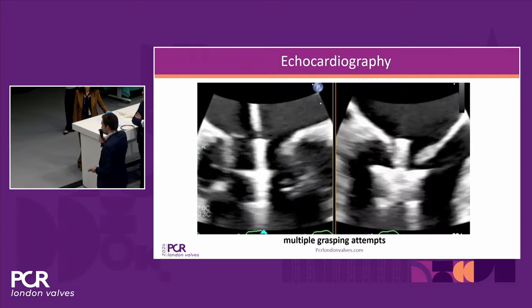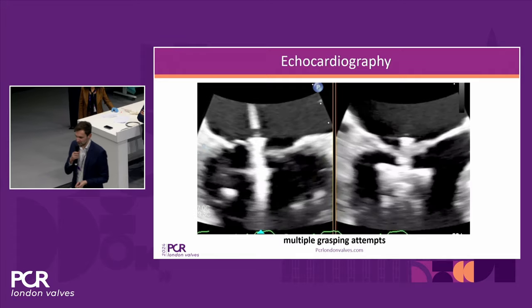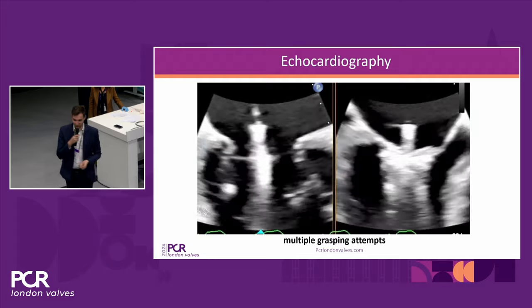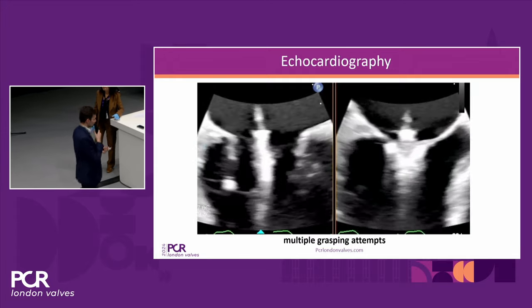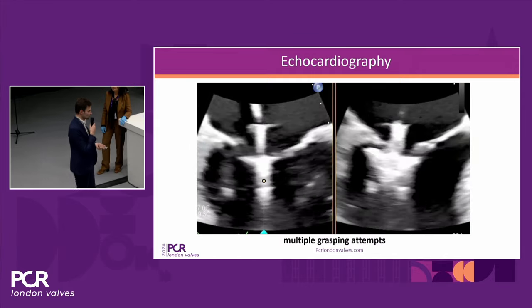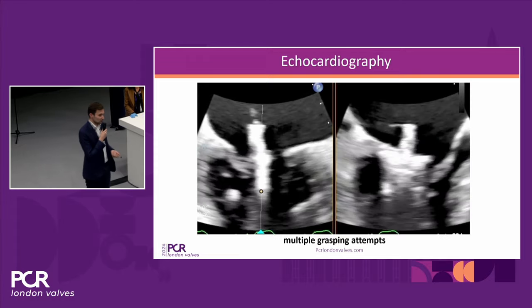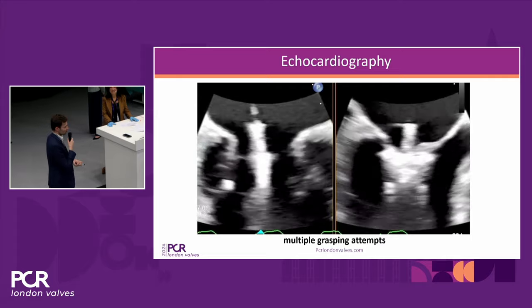And as you predicted, Francesco, we wanted to go more medially, but when we did that, the regurgitation was not significantly improved, so there was still severe regurgitation. So we decided then to do multiple attempts and went then to the center of the valve. And what was actually very easy with the XTW, we also decided to take an XTW to grasp the posterior leaflet. It was long enough, and you can see here nicely that it was possible to grasp both of them at the same time.